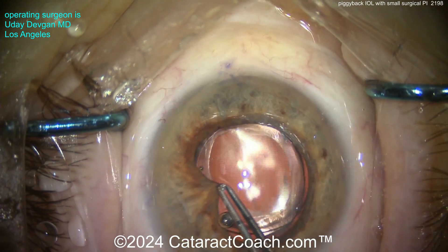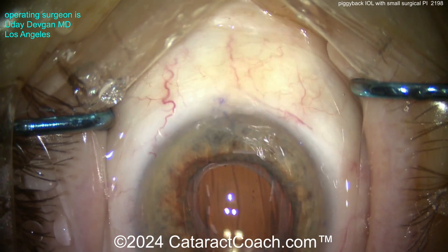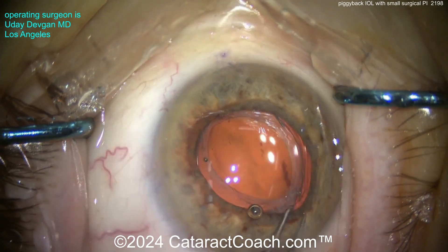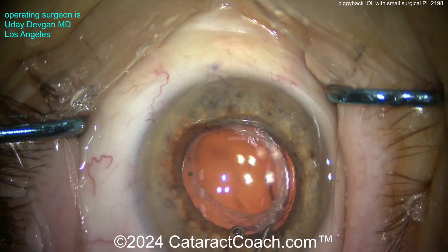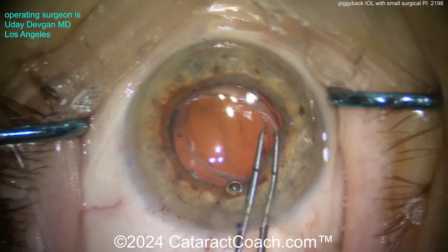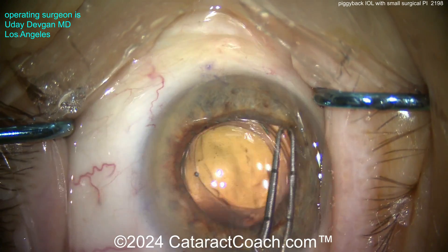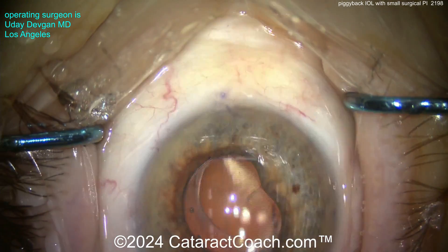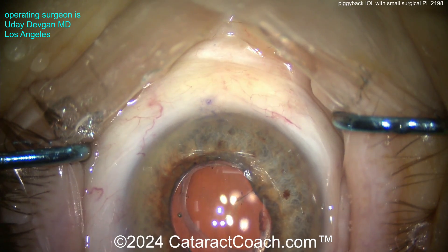What you can do is go in with capsulorrhexis forceps — nothing special — grab the iris gently and pull just a little bit to make sure the haptics aren't causing any gripping or holding of the back of the iris. You can do this 360 degrees. This will also irritate the iris and cause it to become miotic, which is what we actually want. Bring down the pupil, and you can see it's beautifully centered and nicely positioned.